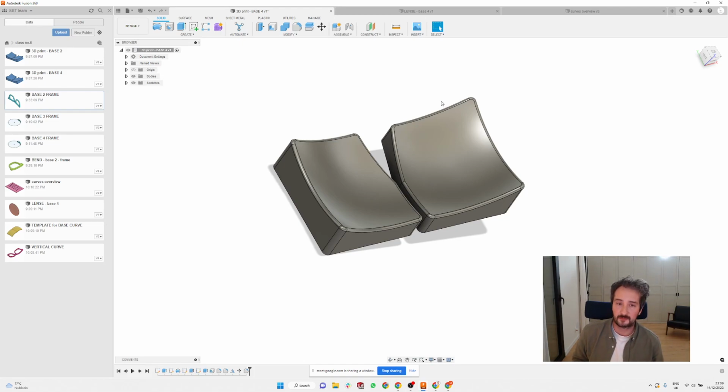because I tried a good few hours today to figure out how to do the proper base curve, but I couldn't do it properly, but I got very close to something that looks like a proper base curve. So I'm going to show you two methods of how to do it, and I'm going to show you how you can do it at home and how you can bend your frames approximately into the right base curve.